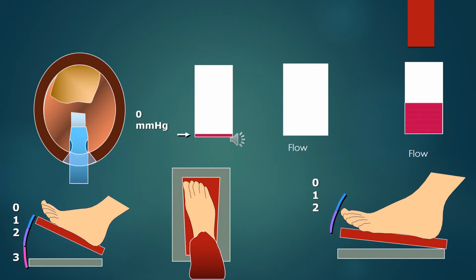So as the surgeon goes from foot switch position 0 to 1, there's irrigation pressure in the eye. However, there's no flow till then. When the surgeon goes to foot switch position 2, the fluid now is drawn away from the eye because the pump is rotating. Pump is drawing fluid from the eye. And as the pump draws fluid from the eye, the small nucleus pieces start coming towards the Phaco tip. Once it comes to the Phaco tip, it occludes the Phaco tip.